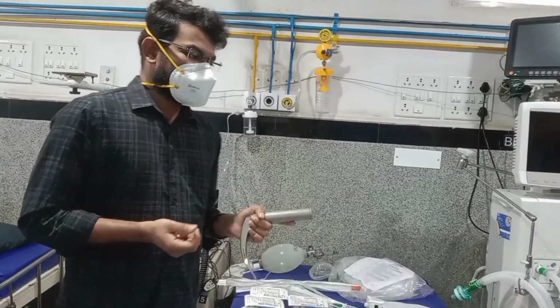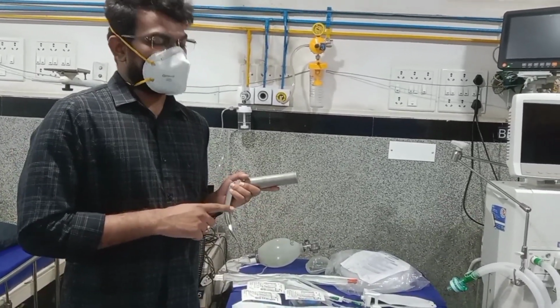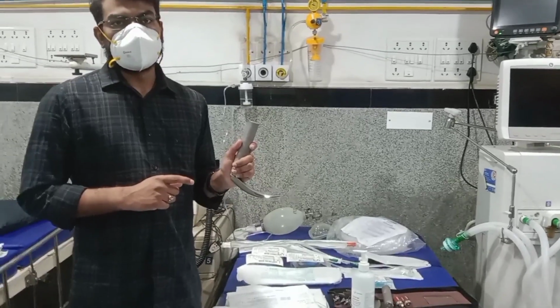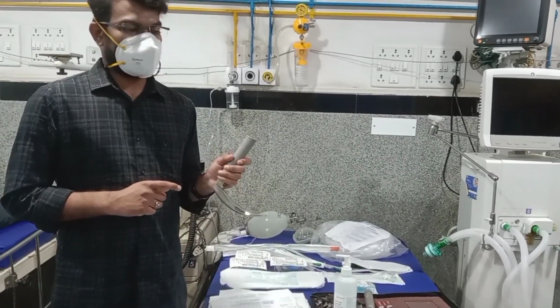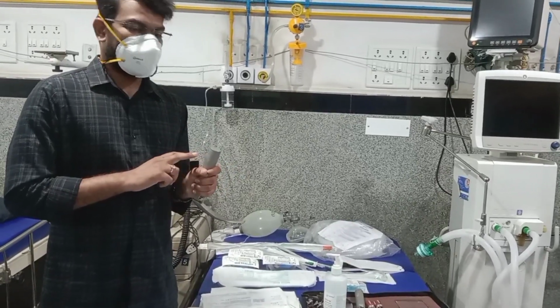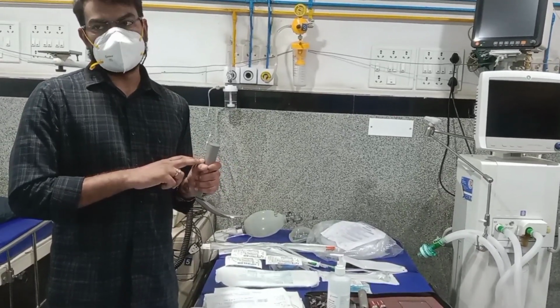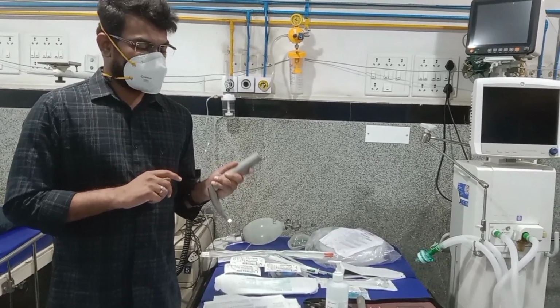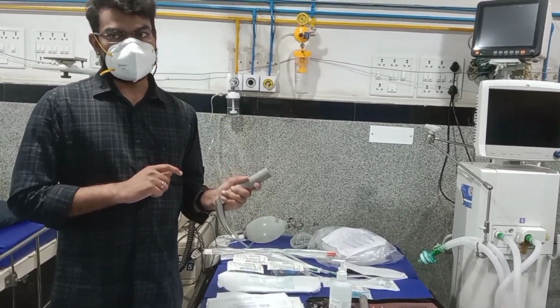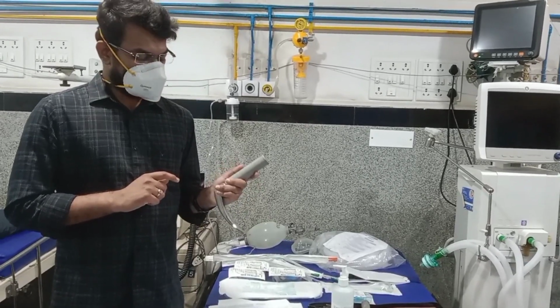Once the blade is passed to the glottis, we lift the chin by using the handle. Throughout the process of intubation, we should never leave the handle. One's hand should never leave the handle during the process of intubation. So you should hold it tight.